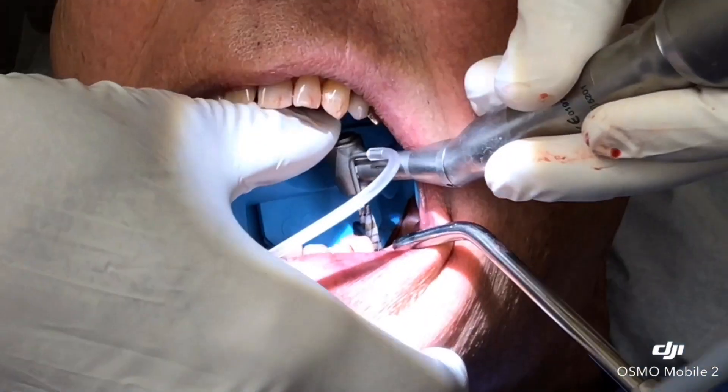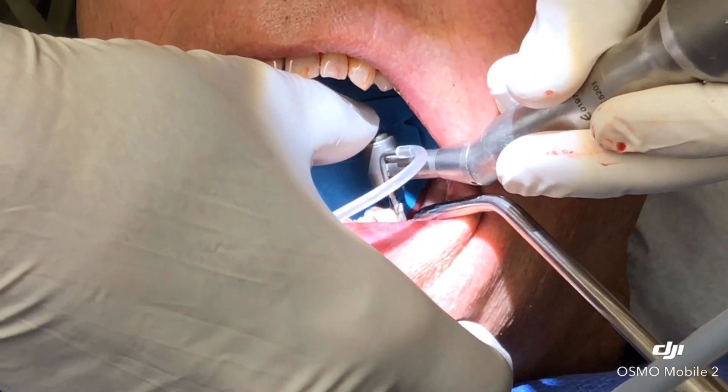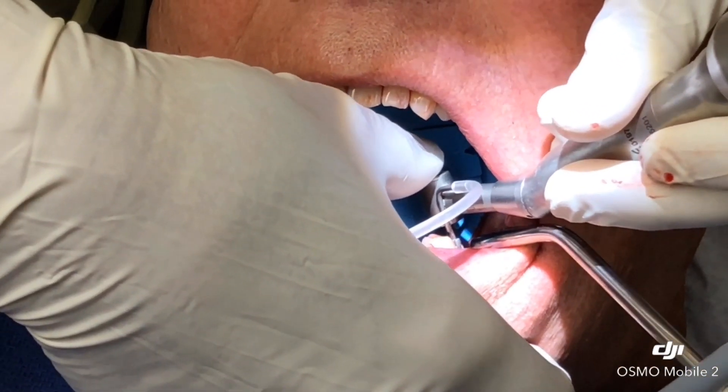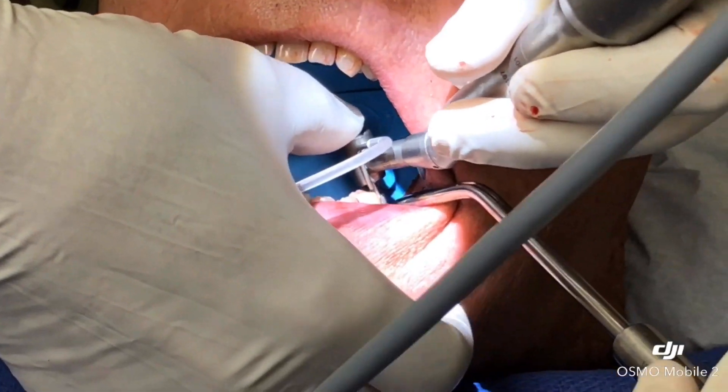The x-ray or the 3D scan showed that we have 15 millimeters of bone depth, so we are using a 10 millimeter implant with a 5 millimeter diameter.